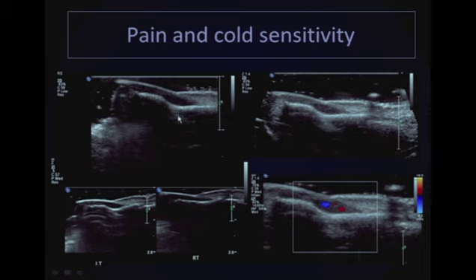And here we are looking at the fingertip. This is the distal phalanx. This is the nail. We're looking at the nail bed here. And perhaps you can see there's a hypoechoic structure at the base of the nail bed here. But by optimizing the images using the MSK presets, you can see now that the hypoechoic structure is brought out in distinction to the more hyperechoic surrounding tissues.